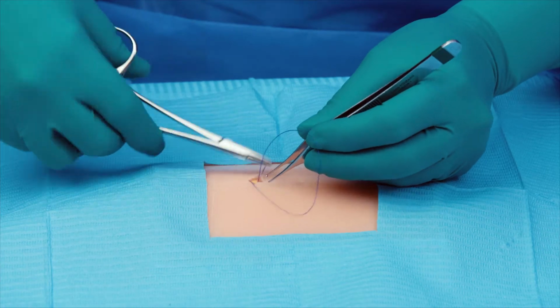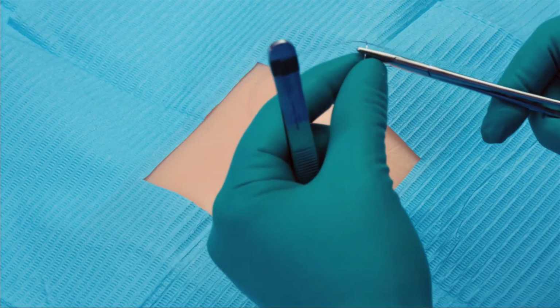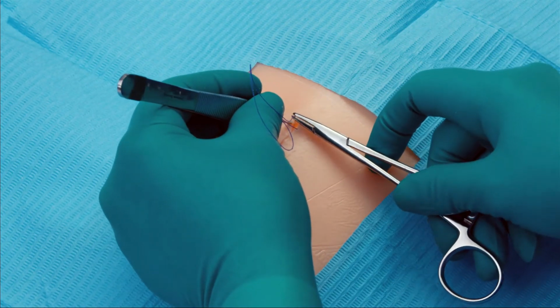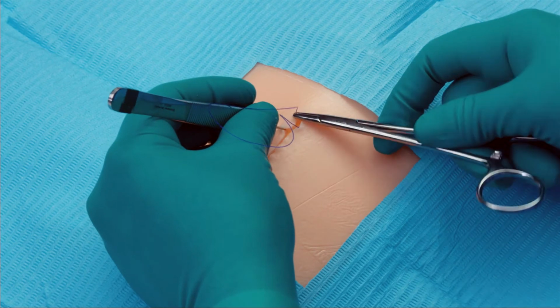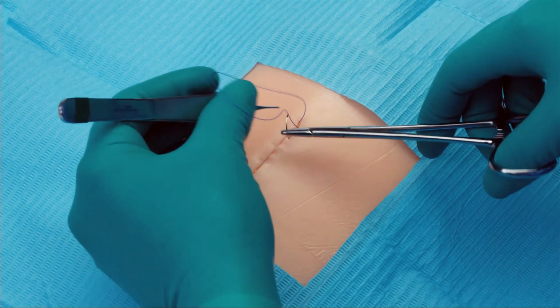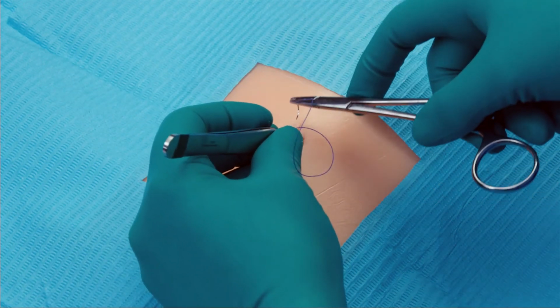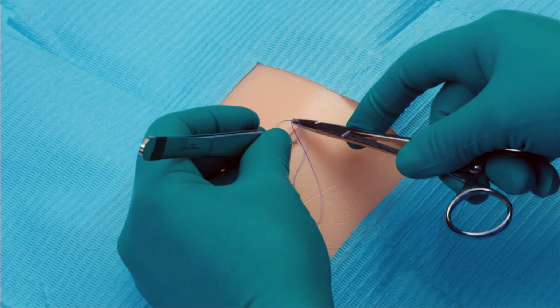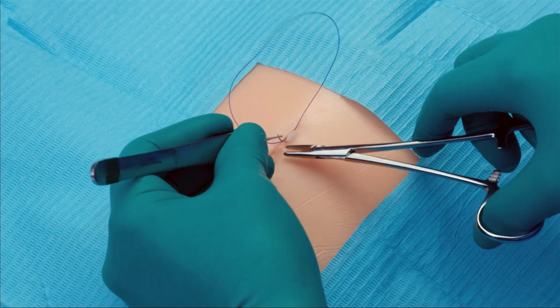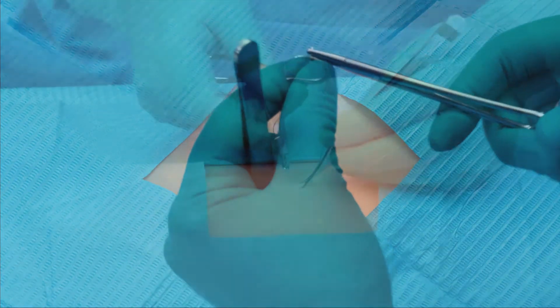Now that the deep dermis is approximated, we can close the superficial layer with the same Quill device. In a running subcuticular fashion, take equal bites of the tissue in the horizontal plane of the upper dermis. It is important to come directly across the tissue line when deploying the device in the subcuticular layer to ensure good apposition.